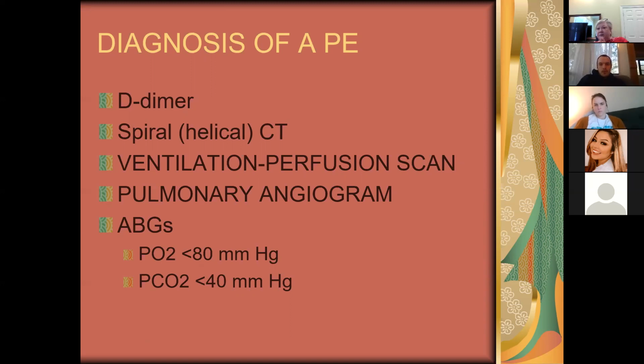If you have a hospital that has it, they can run a helical CT, a spiral CT. Not all hospitals have a spiral CT. It costs a lot of money. I have to tell you, they may have it now. This was several years ago, but they also run spiral CTs for kidney stones.